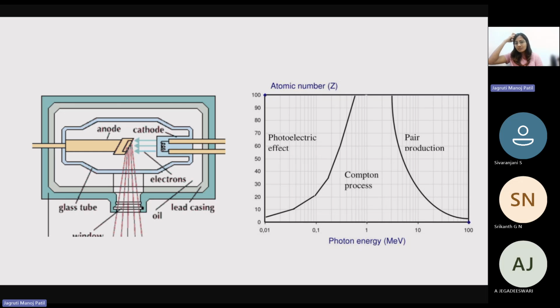At times you see that they are asking you to bend, so you have this sagittal position. At times you are directly laid on your back, so it's a frontal position that you're looking at. So that's how this also works. Next time when you go and have a scan, you'll know how it's actually working.